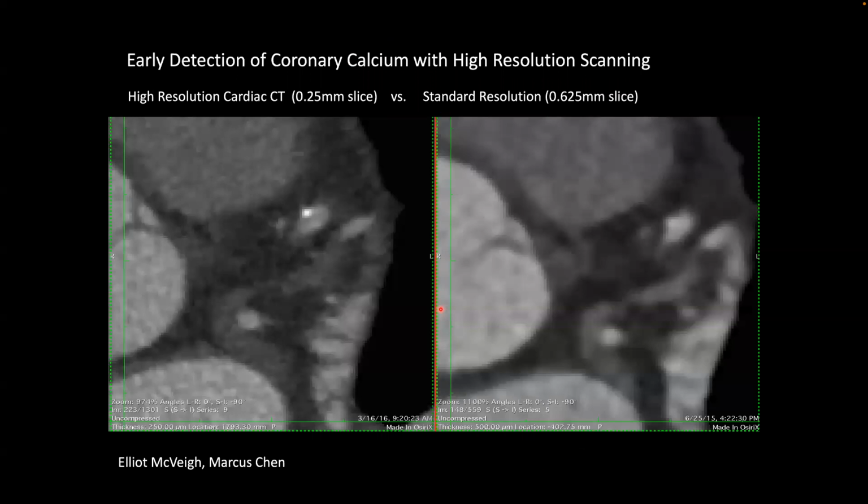And in this patient, actually, this scan was an experimental scan at the NIH. So they did a patient in this scanner plus another scanner 6 months later. And so here's a bit of a coronary vessel with a very bright piece of calcium. And that's what the calcium looked like in the standard scanner, right? So, you can visualize things just better. But again, it comes with the caveat that you need to be able to get the x-rays through this patient with the small spot size.